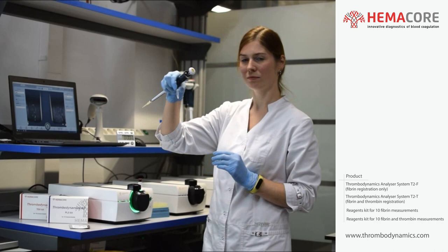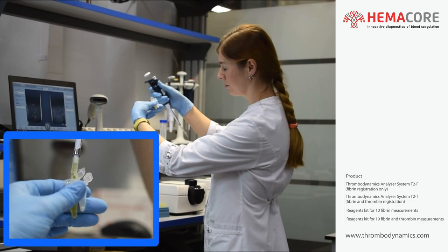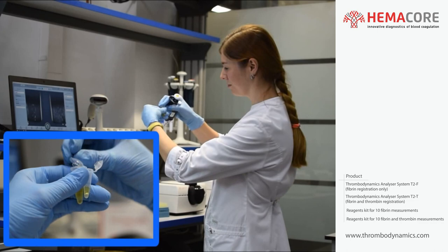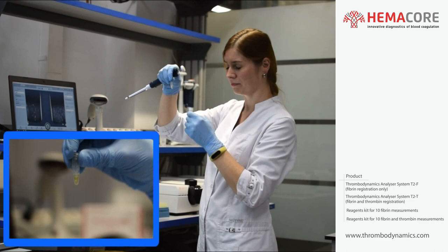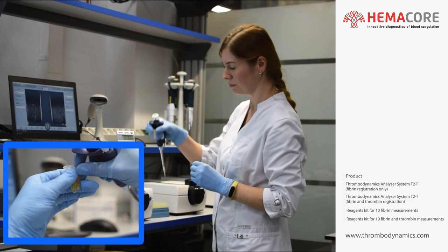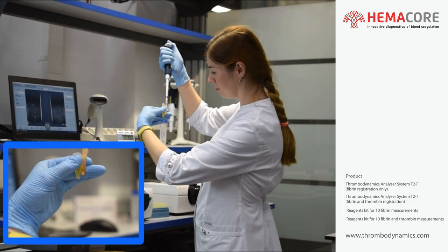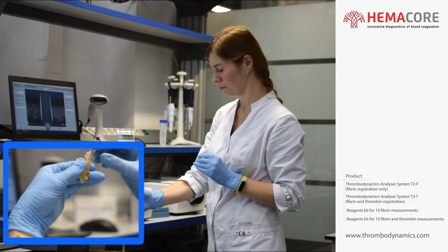Take reagent 1 tube relating to channel 1, open it, and place 120 µL of PFP sample number 1 into it using a pipette with single-use tips. Close the tube and gently knock it with a finger several times to dissolve the dry substance inside. Ensure that the dry substance has dissolved, then place the tube back to the preheated place in the thermostat. Repeat for sample number 2 using reagent 1 relating to channel 2 — this channel is for Thrombodynamics 4D in our video. Reagent 1 of the PLS kit and TDX kit differ in composition and for convenience have different tube colors.